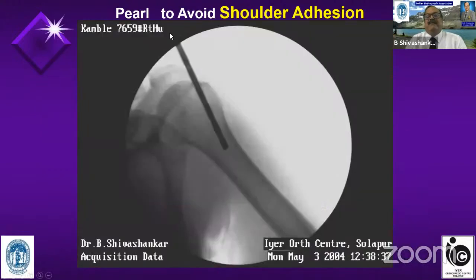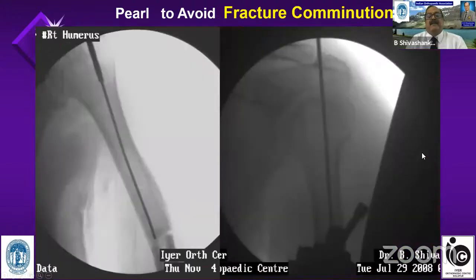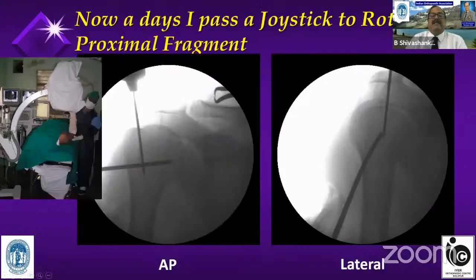Then I take out the guide pin, and through the cannulated drill bit, I pass the guide wire and reduce the fracture. See, confirm it in AP and lateral. See that it is going properly in the center.